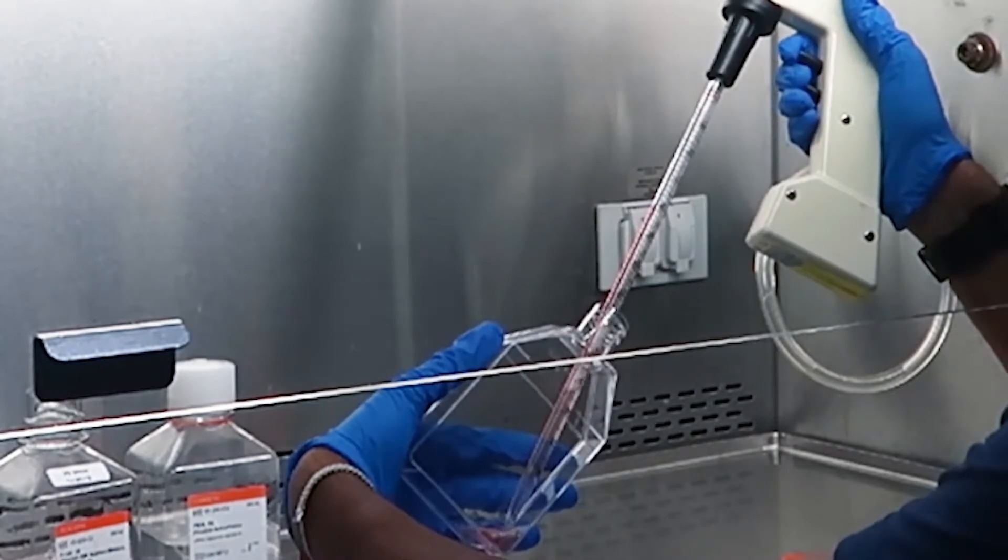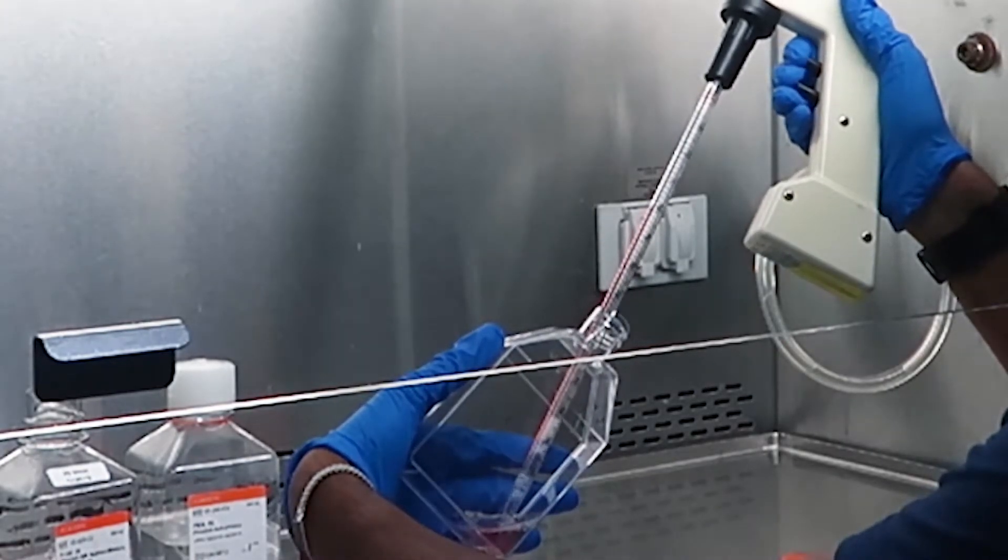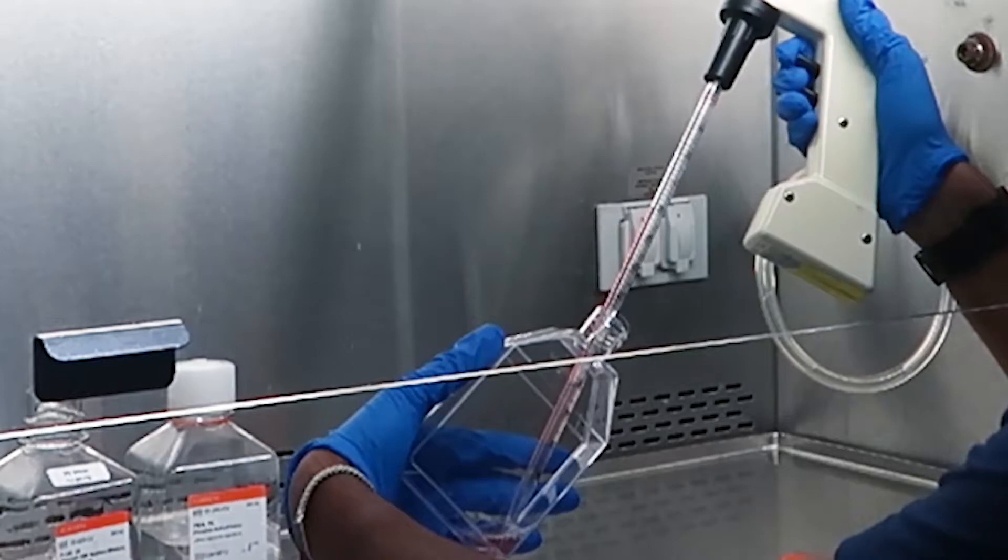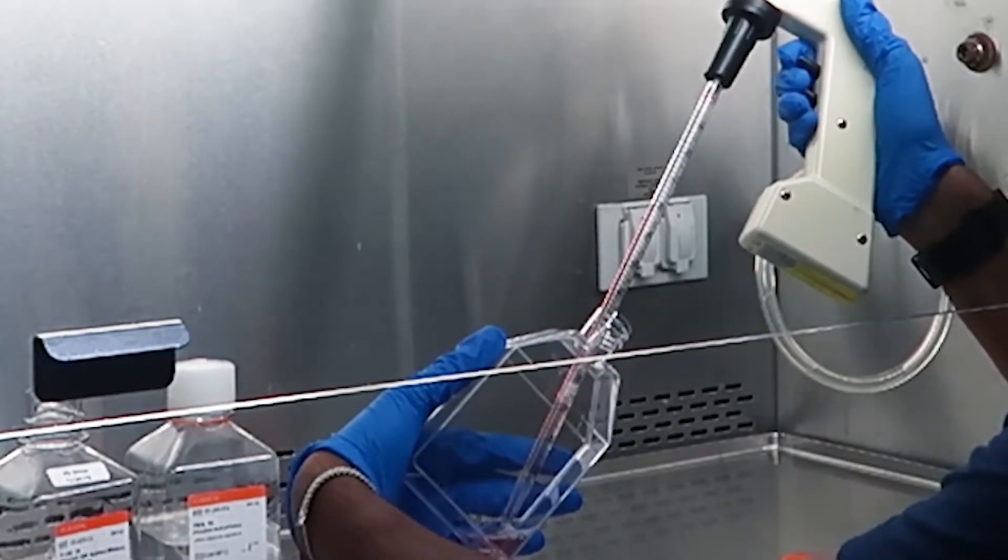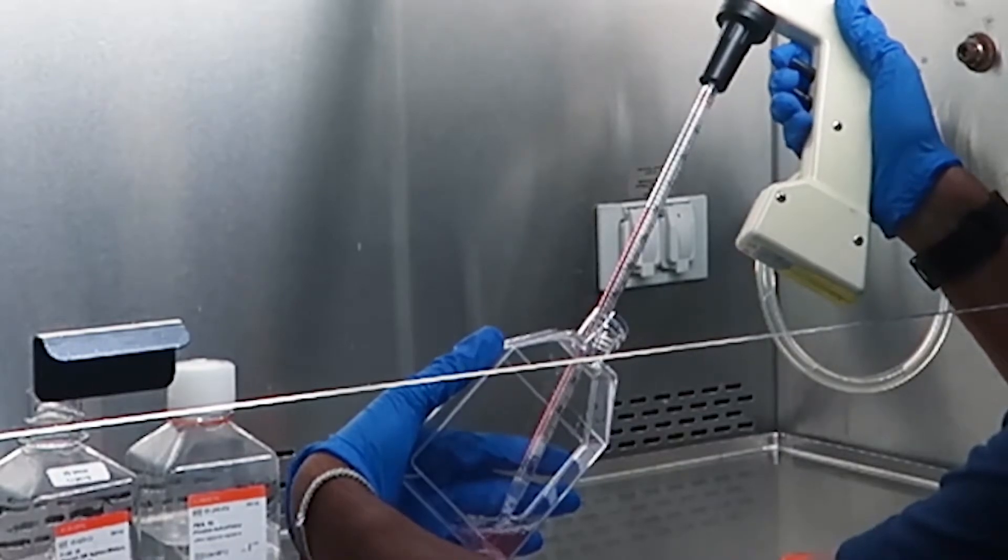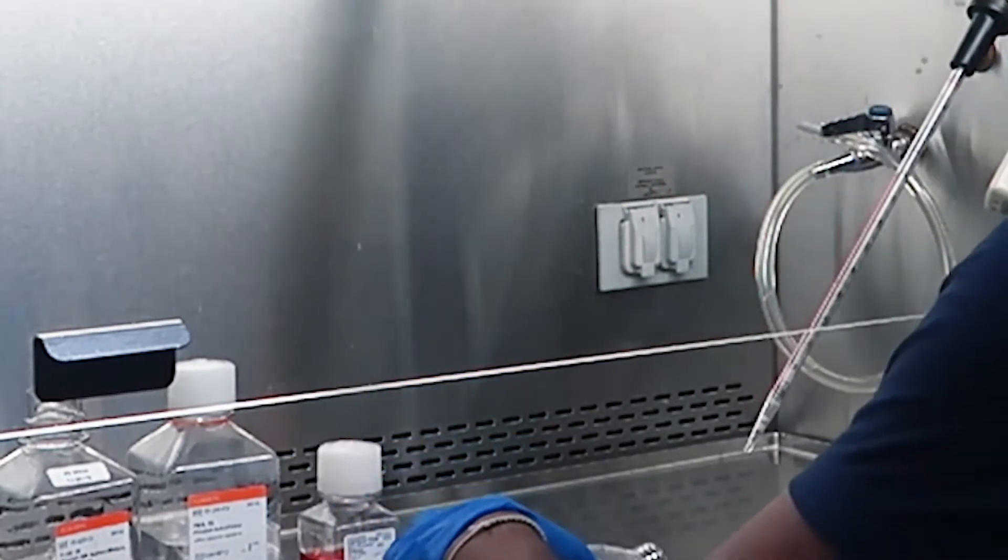There's also a balance when pipetting these cells because pipetting these cells for too long or too fast can cause mechanical damage and break the cells. Earlier passages or primary cell lines are more susceptible to this than later passages.